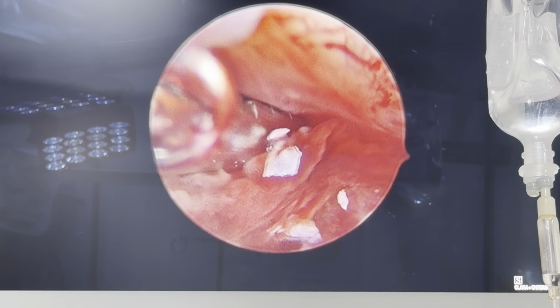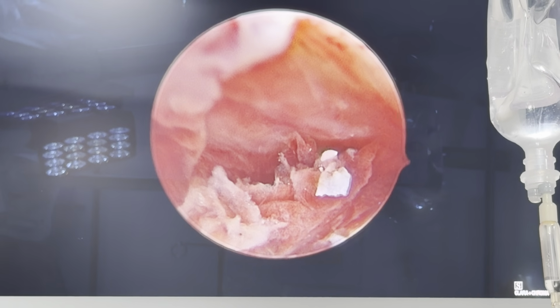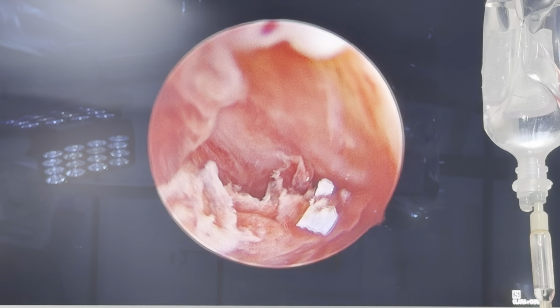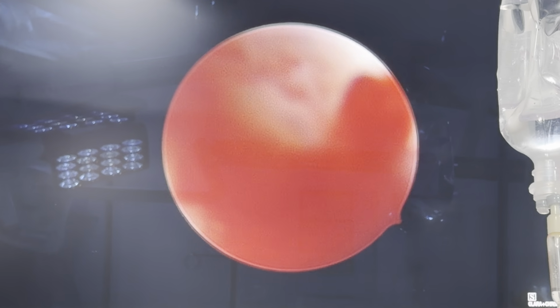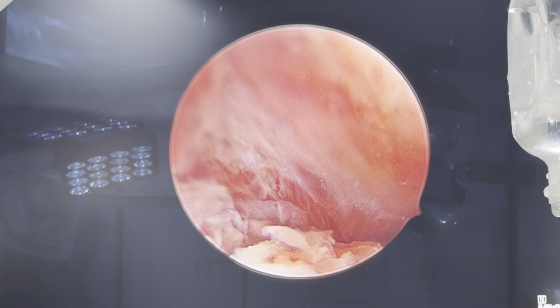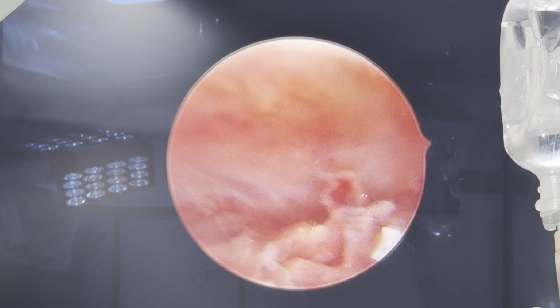Again, the grasper went in without any resistance, so I knew that the endometrial cavity is right there. And I knew I'm not in a false passage once I saw the opening of the endometrial cavity as a black hole, and I navigated my scope through it with some maneuvering.